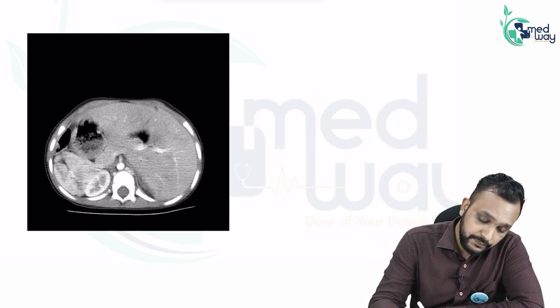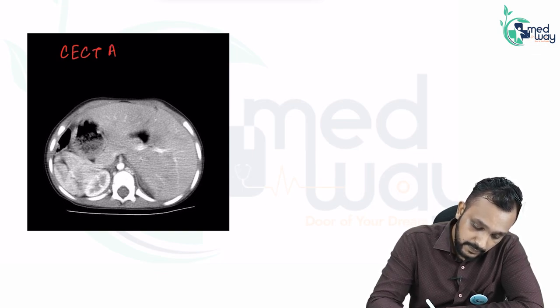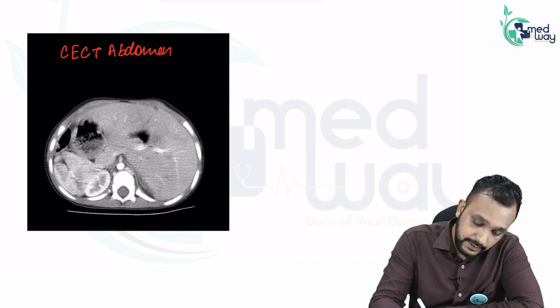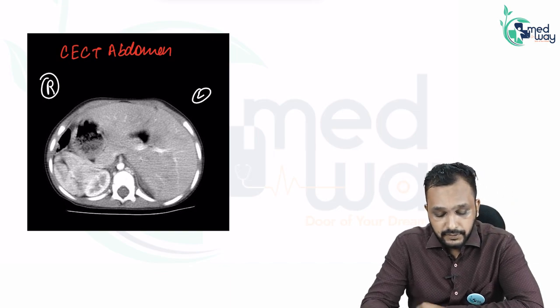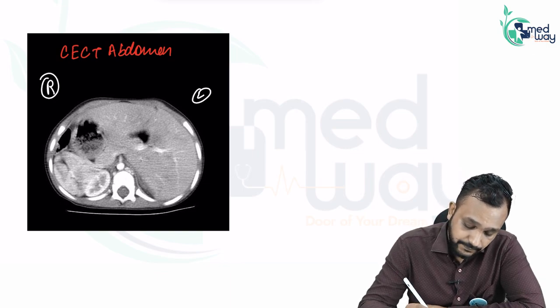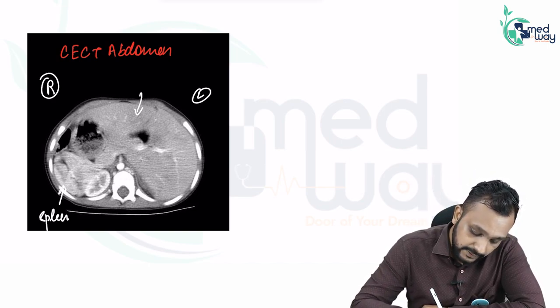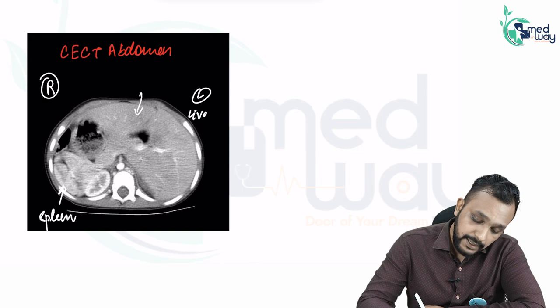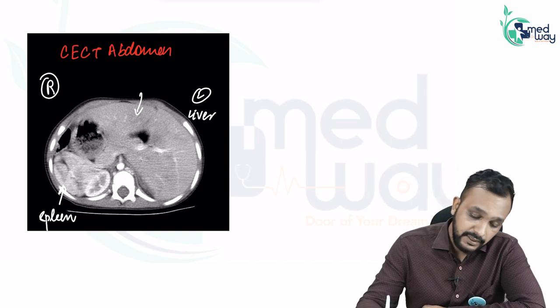Now here in this image, what are you able to see? So this is a CECT abdomen image, and this is your left side and this is your right side, right? Here we can see that, if you look at the liver, the liver is normally present on the right side of the body, and this is your spleen, which is normally present on the left side of the body. So here the relationship of liver and spleen is reversed. Spleen is seen on the right side and liver is seen on the left side.